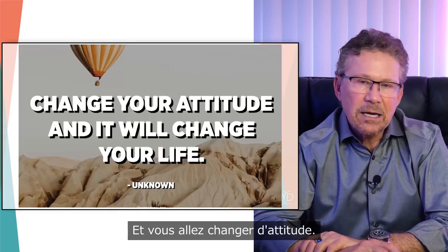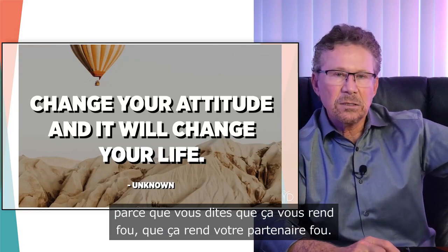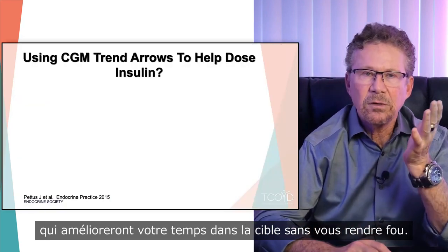And you've got to change your attitude. You really do. I know so many of you set your alerts so high because you say it drives you crazy, drives your partner crazy. You just got to figure out the levels that will improve your time in range without driving you crazy.